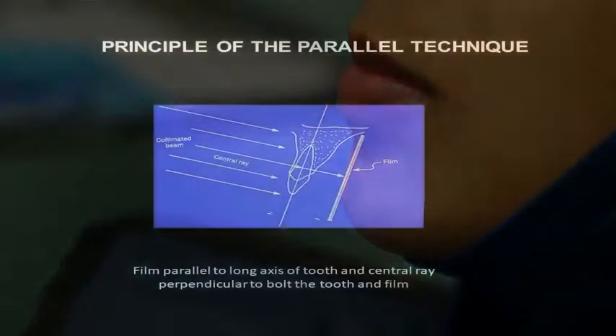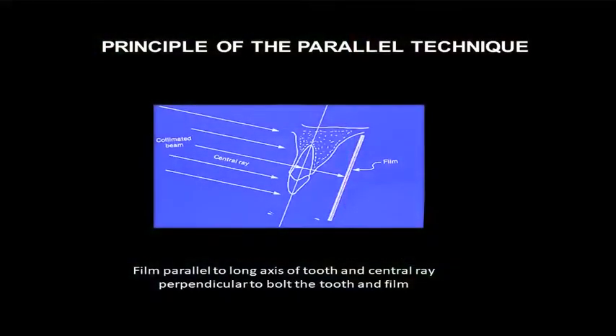Now your patient is ready and we can start taking the periapicals. The basic principle is that your film should be parallel to the long axis of the tooth, and your central ray is directed perpendicular to both the tooth and the film. To do the parallel technique we use what we call a run holder.